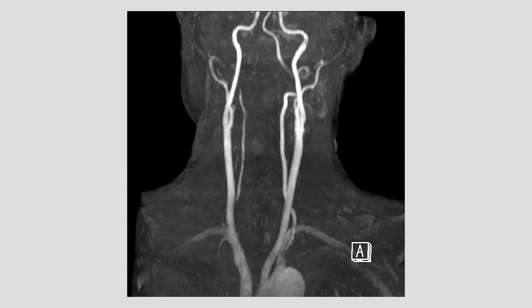Let's move on to number two. Number two is going to be the carotid MRA, the neck. It's the exact same thing. You want to see nice, bright, straight arteries, no breaks in between, no dark areas inside the arteries and vessels. It's important because, as you can notice, it connects the heart from the bottom portion to the brain. So this is a very common and very important test to do.